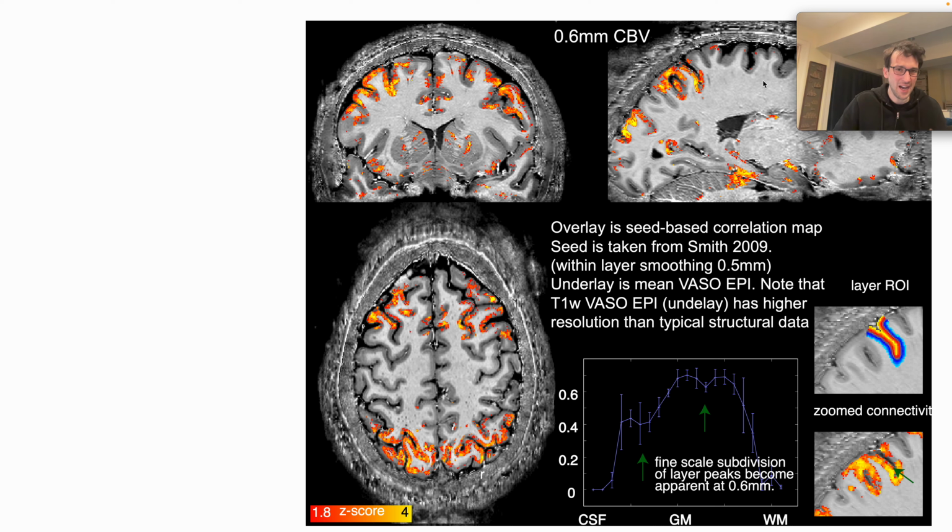Based on the EPI itself, it looks like we have a very high localization specificity and crispness. It's not looking very blurry. There are a bit of distortions left, but it looks better than any structural scan you would expect from a normal scan. But still, a lot of functional responses in these connectivity maps look blurry. So it seems that these recurrent connections basically always engage everything.